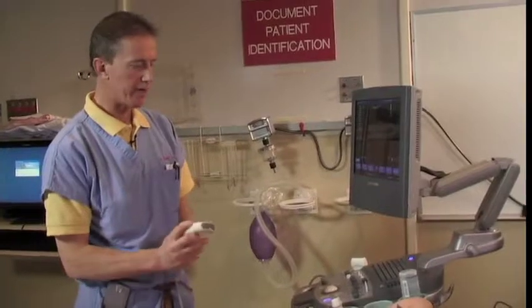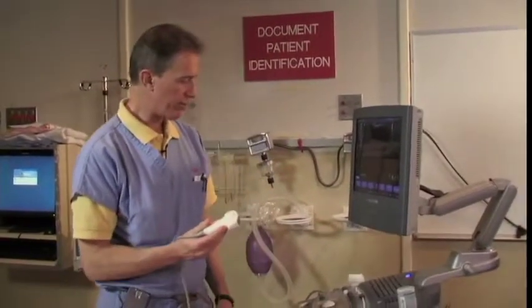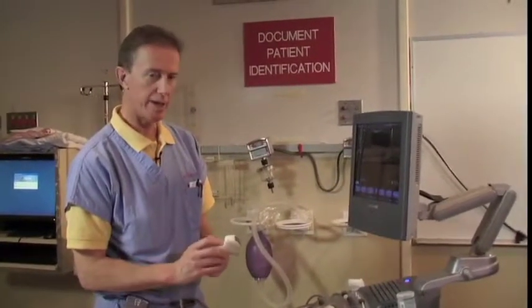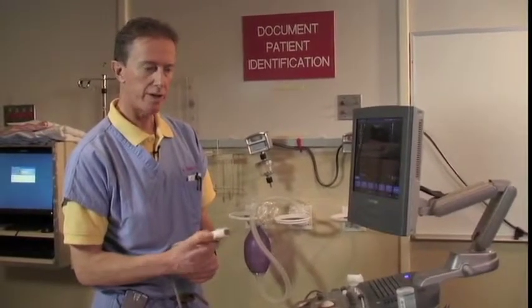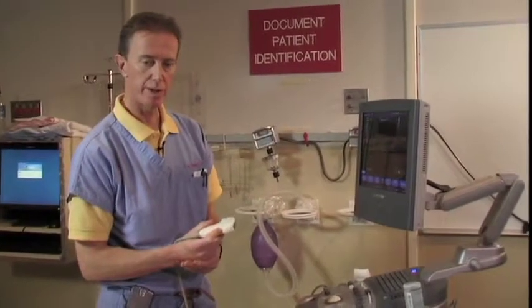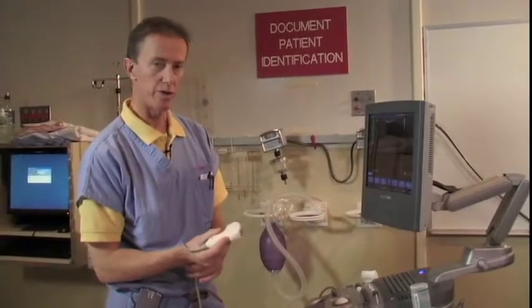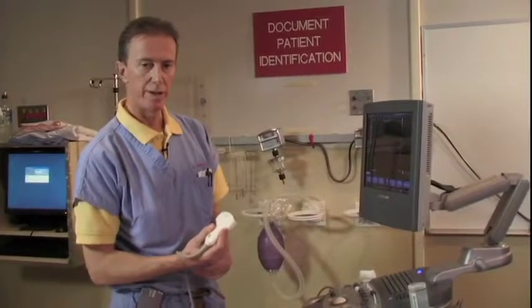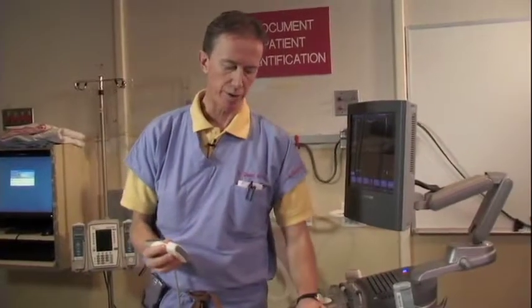The exam can be used with almost any probe. Some people prefer a linear array high frequency probe, but I personally find that a curved array general abdominal probe works very well. The curve actually seems to emphasize the movement of the pleura, and it's also useful because at the completion of the FAST exam, one doesn't want to be wasting time changing probes.